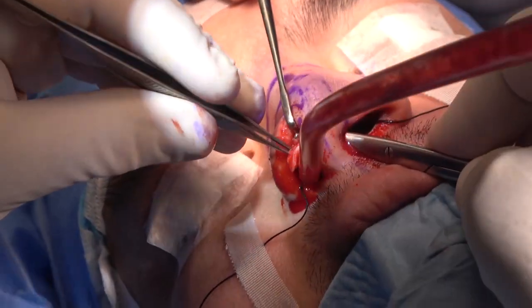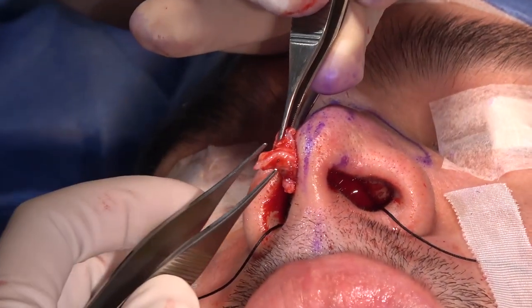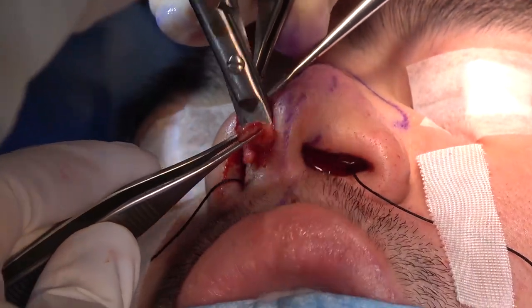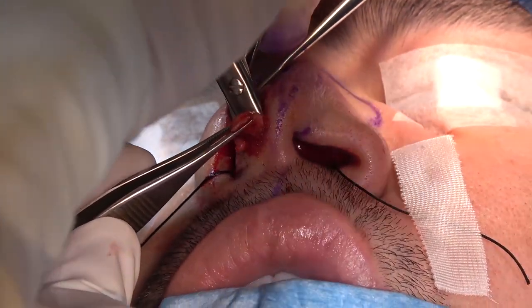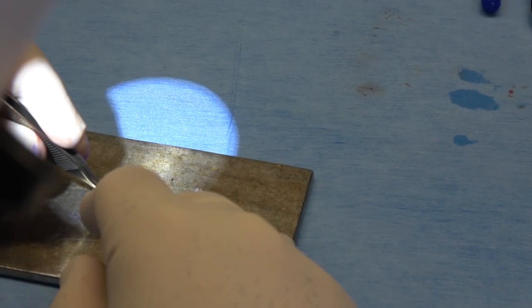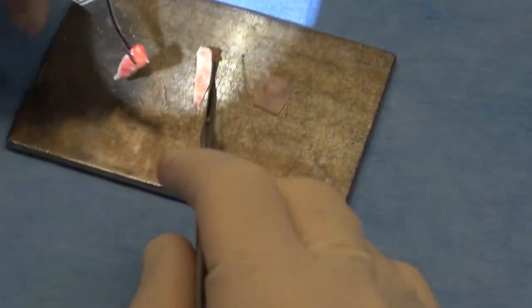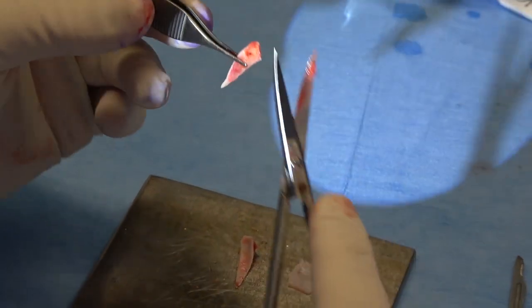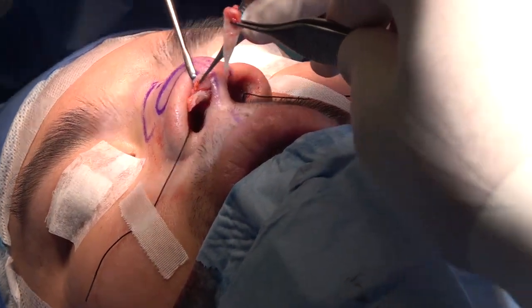Suction, clean. Okay, hold. Give me sharp scissors. With sharp scissors, we go between the two medial crura on the way down. Okay. Hold, keep holding this one for me. And we got our graft now, the septal graft not enough. So we have a nice tip graft and a nice columellar strut from the conchal graft. Good that we went straight and we obtained a conchal graft. So we have a nice conchal graft.